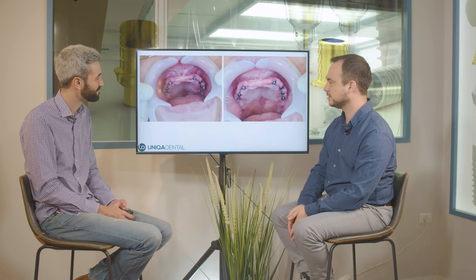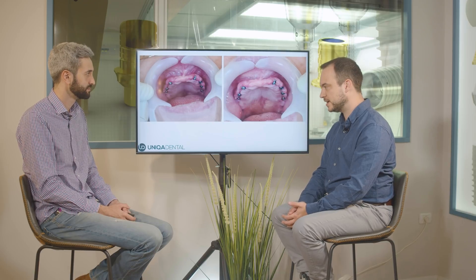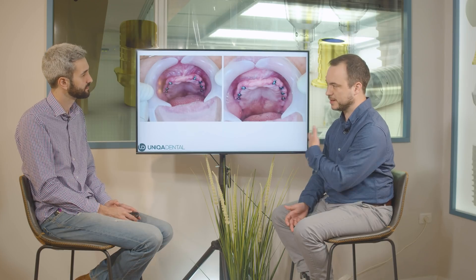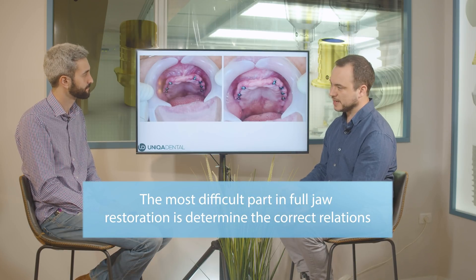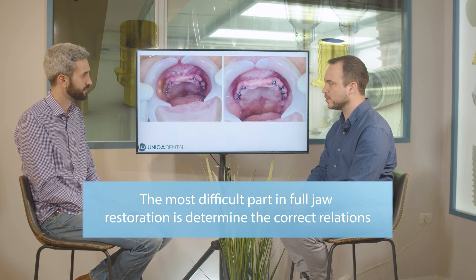Today we want to make a bridge on the upper jaw — a 12-unit bridge on 7 multi-units, on 7 implants. The biggest problem with this type of restoration is determining the height of the bridge and the occlusion, because in this case the patient doesn't have anything: no provisional bridges, no teeth, nothing at all.